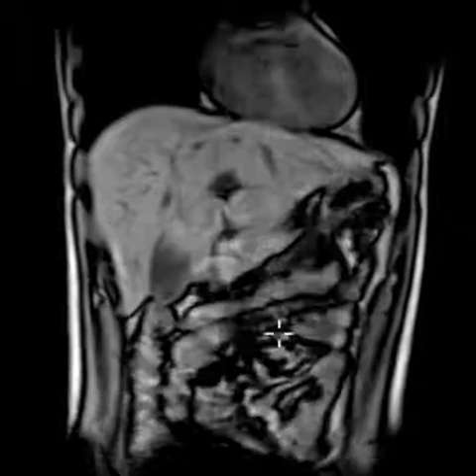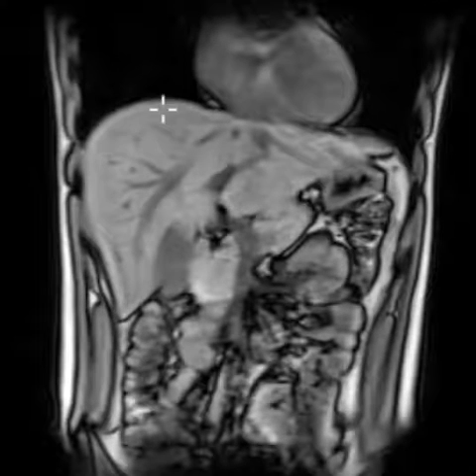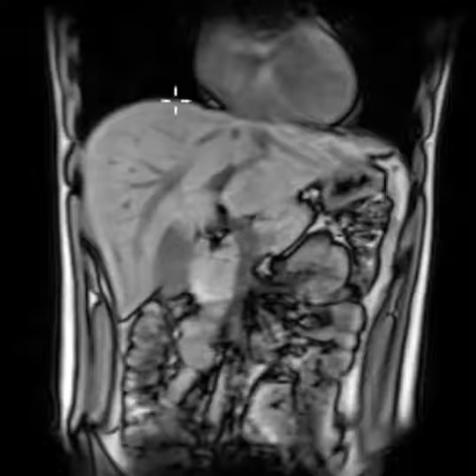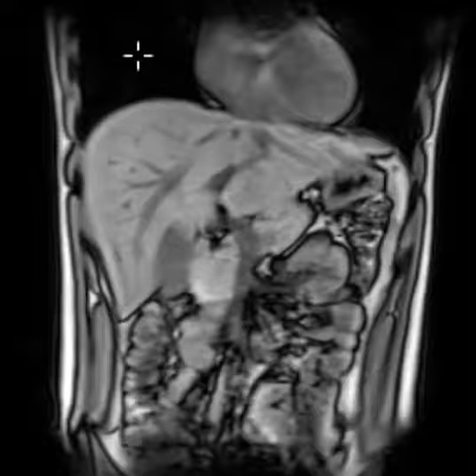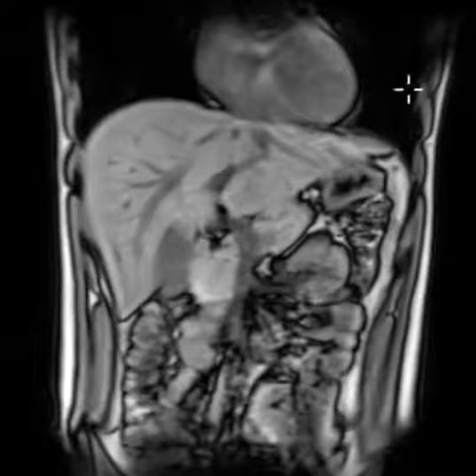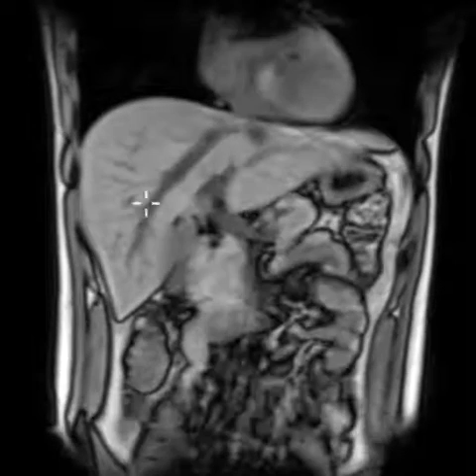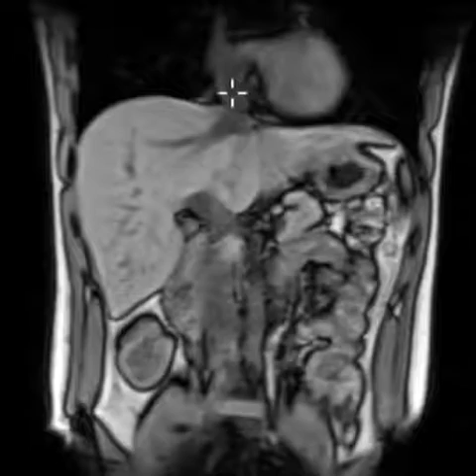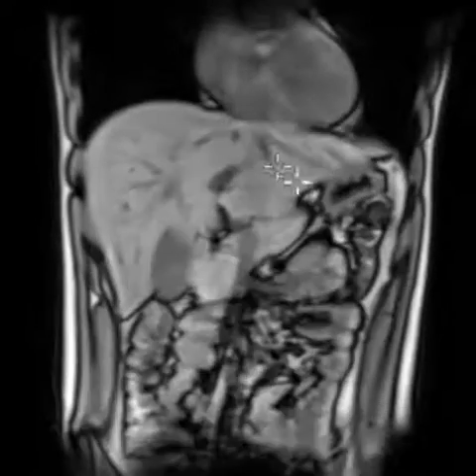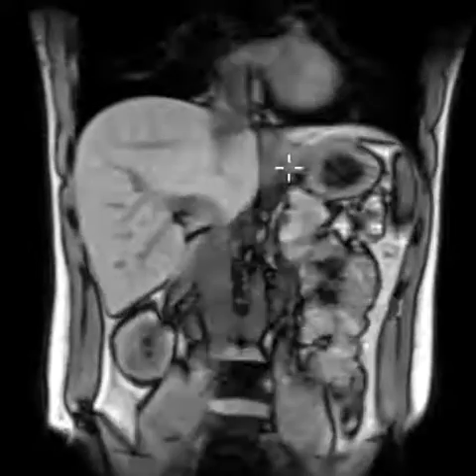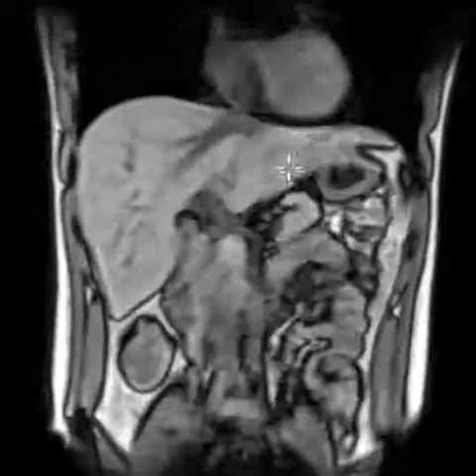Just one last quick look. This is a view where the liver is here in the right upper quadrant. You can see the diaphragm above the liver — this is the right lobe — and here's the lung on the right, here's the lung on the left, and this is the heart. On this view you can see the hepatic veins — these dark areas — draining into the inferior vena cava that goes up into the heart right nearby. This is just a nice normal appearance of the liver.